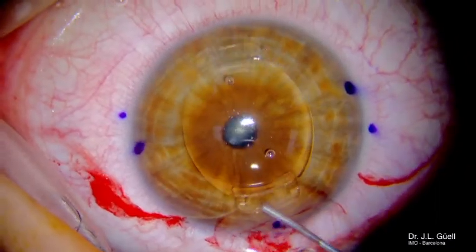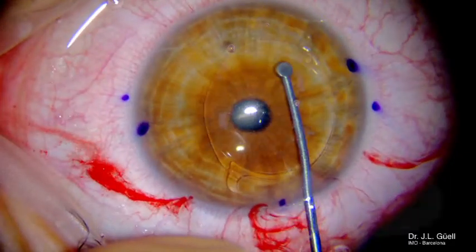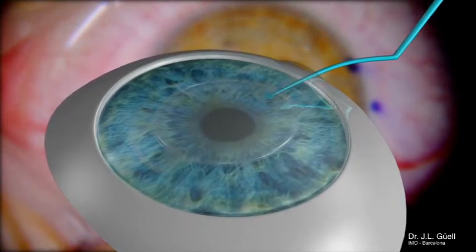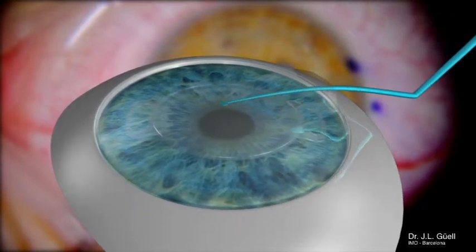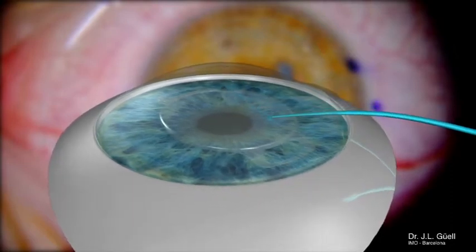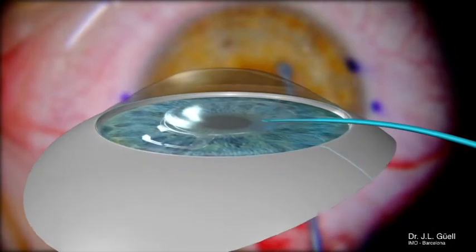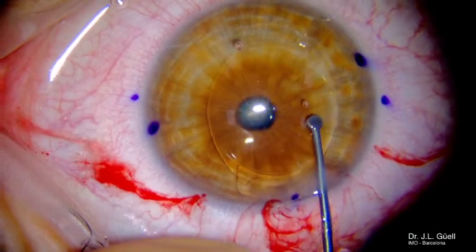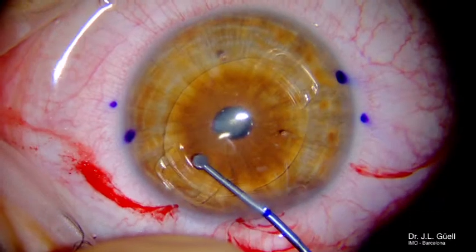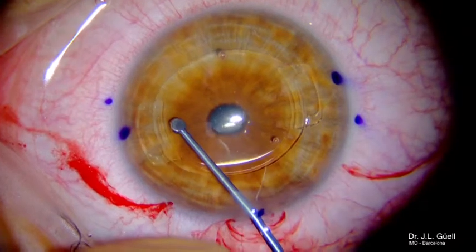Once the optic is inside the eye, we gently push the proximal haptic in order to have all the lens in the anterior chamber. Some more viscoelastic on the front surface of the IOL is introduced to protect the endothelium, and with the positioning spatula we take special care on the centration of the optic over the pupil and the orientation of the haptics on the desired axis.